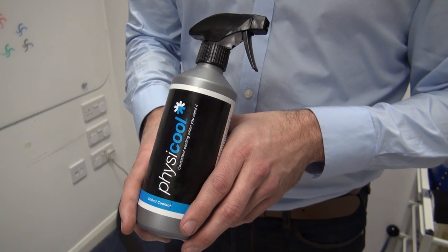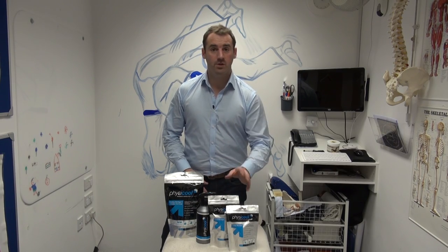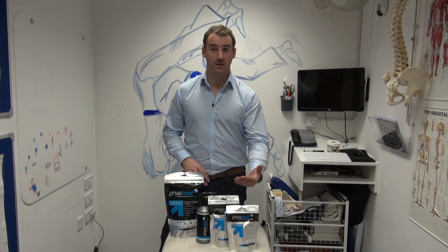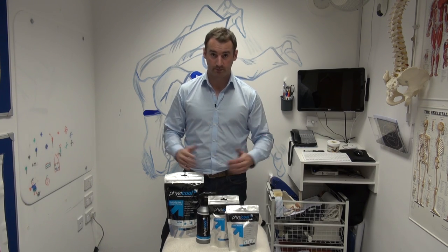The coolant is used to recharge the bandage and will give seven recharges. Each bandage can be continually used. After two to three hours of consistent use, the bandage will start to dry up and cease to facilitate cooling. Then all you need to do is top it up with the coolant to continue using it for as long or short as you want. As long as the bandage remains damp, it will continue to cool.